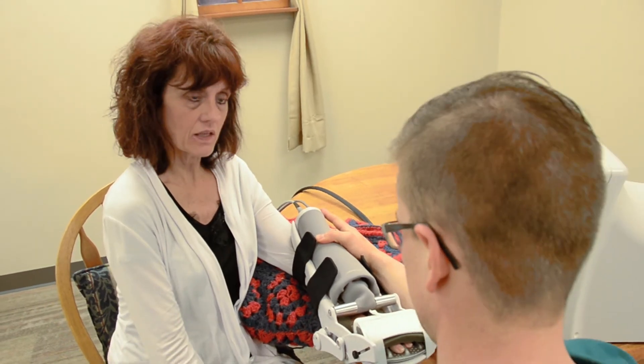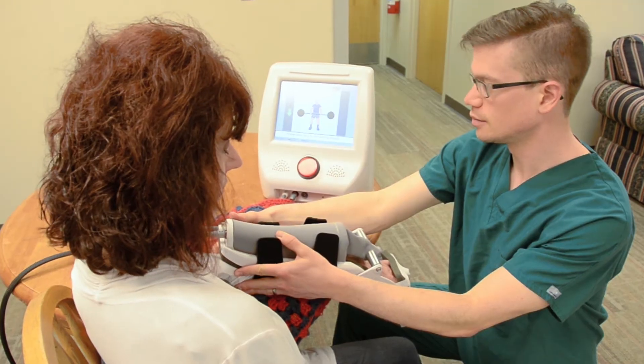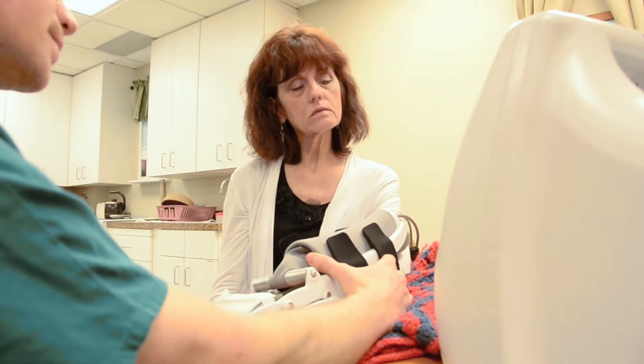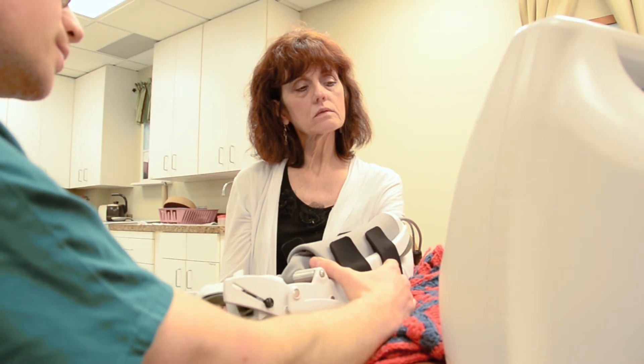I definitely am seeing results because I find that my hands stretch. In the morning it has a stretching exercise that you go through that kind of beats some of that spasticity, and just the repetition and the awareness of this hand — that it's here and that it can work. I see a lot more change in the upward movement than the down.